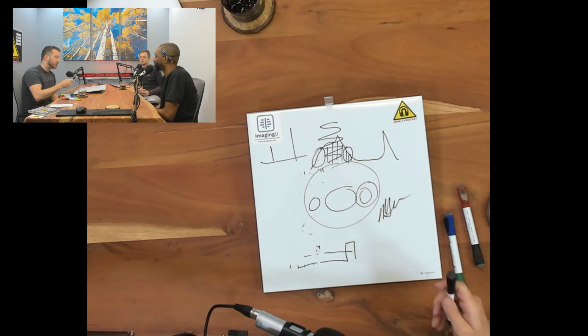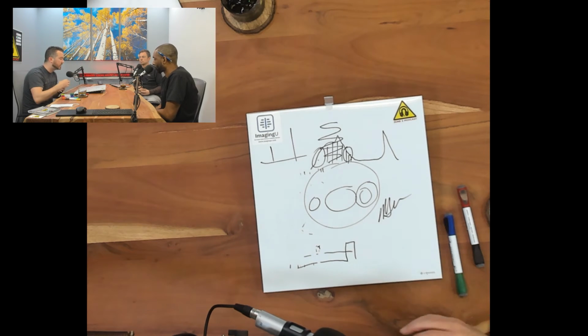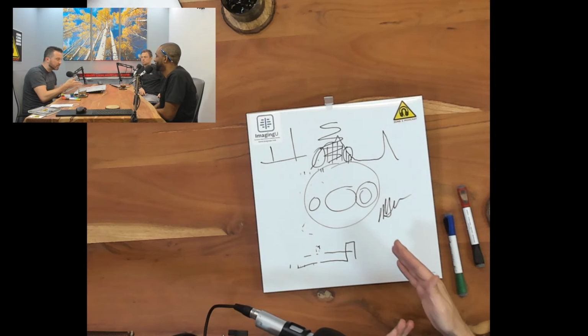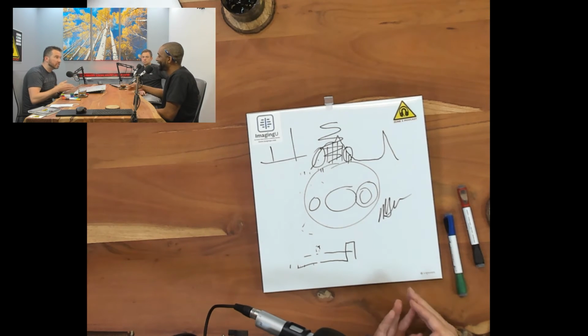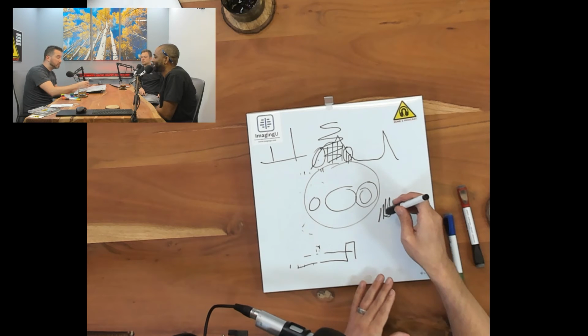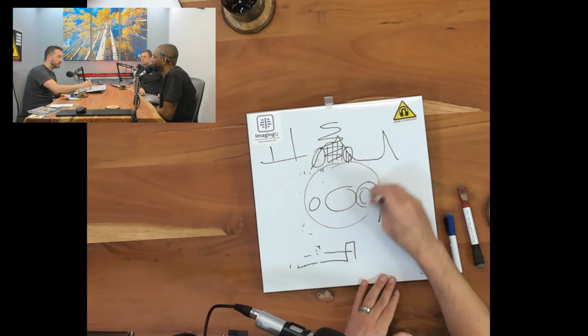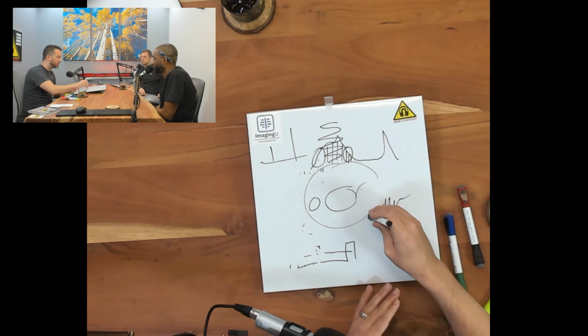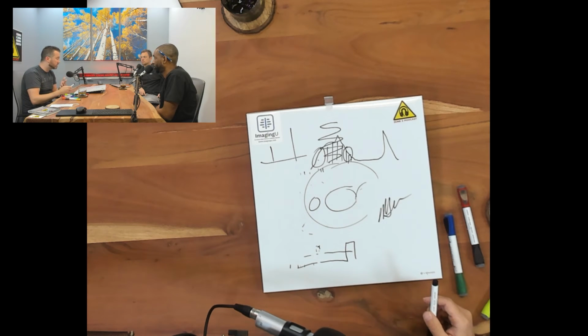Yeah, sure, there are other things at play. As you get further away, you start to have drop-off, and the manufacturers only have a certain useful area that is affected by gradients and things along those lines, but that's just a useful clean fat sat. There are so many different fat suppression methods, but inversion recovery allows anything to be inverted that you want.